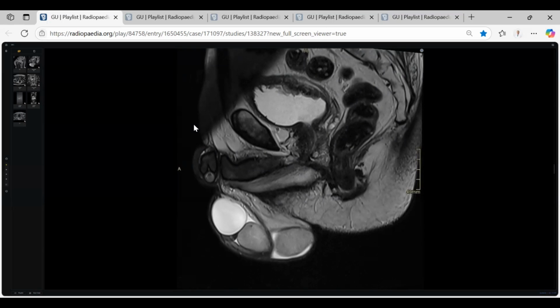What is the nature of the prostatic metastasis within the bone scan? What is its appearance? Sclerotic metastasis. If we do a PET CT, what is the name of the tracer for detecting prostatic mets? MDP? Gallium. Gallium PSMA. And for recurrence, choline.